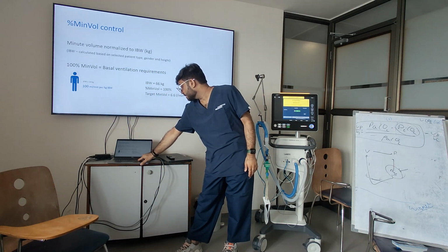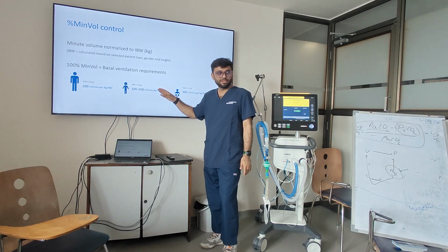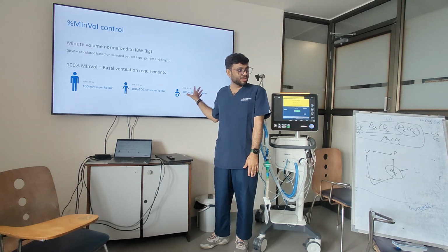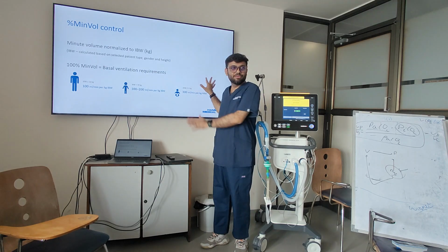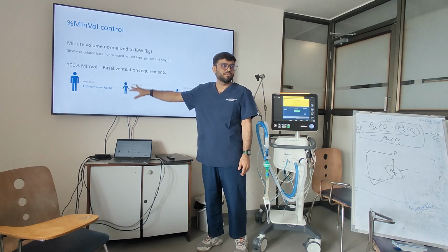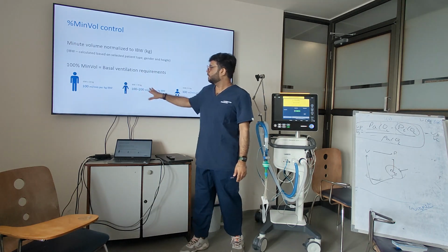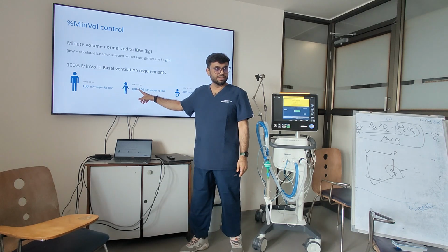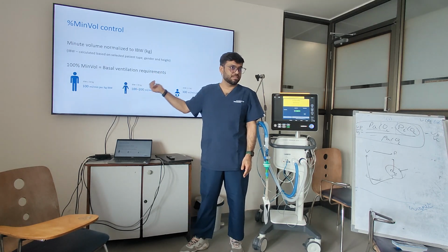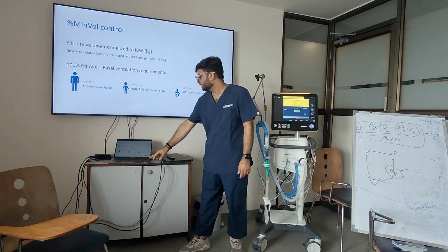Similarly for pediatrics, you will see 100 to 200 ml per minute per kg of ideal body weight. Okay, for neonatals, we were discussing going by the actual body weight instead. Ideally, as there are not many studies for neonatal, ASV is mostly used very frequently in adults and pediatrics. But for pediatrics, it should be less than 30 kgs, or above 15 kgs. So between 15 and 30 kgs, you are considering that under the pediatric category.